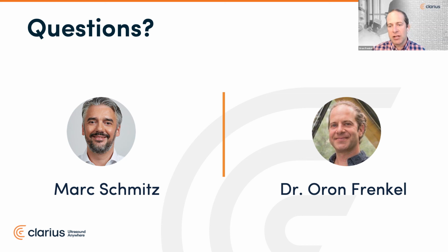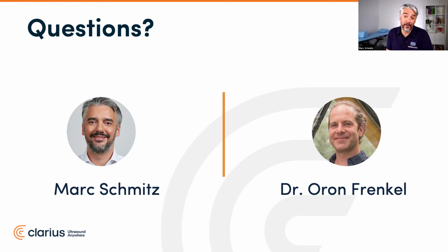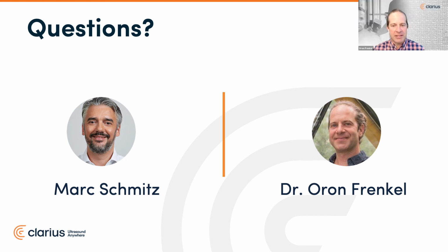So first one, Marc, do you consider, I think you already answered this, but the rotator interval mandatory in routine shoulder scanning? I always do it, actually. So it's not standard protocol, but I adopted it as standard protocol for me. And I really advise other people to do this as well. Great. Yeah, I think you made a pretty compelling case there.